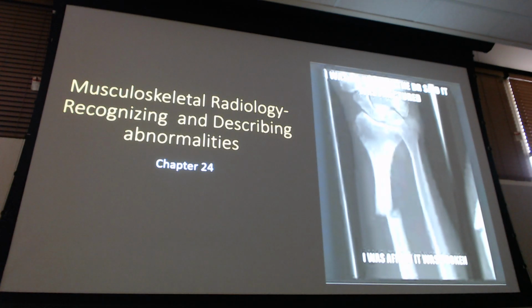It's okay. I want to clarify some stuff. We were talking about the avascular necrosis, and I had some really good questions. Understand that with avascular necrosis, we were talking about that sclerotic area, that increased density. This is what happens when you miss scaphoid fractures. When we do the x-ray, it's normal. They come back in a week to 10 days and I do the second x-ray. I'm not actually looking for avascular necrosis. I'm probably not going to see that sclerotic lesion after just a week. But what stands out more is that scaphoid fracture.